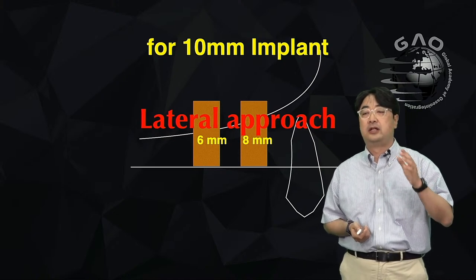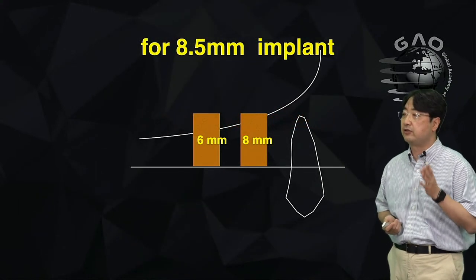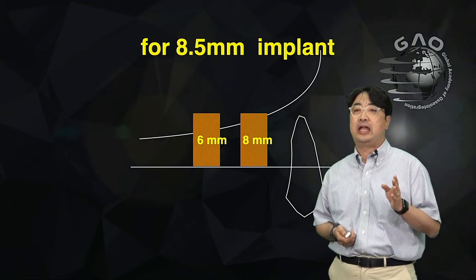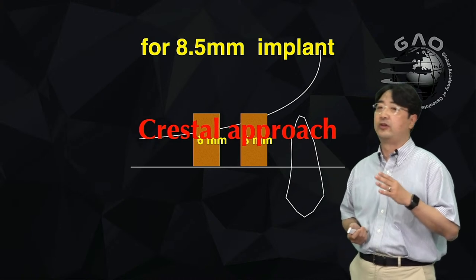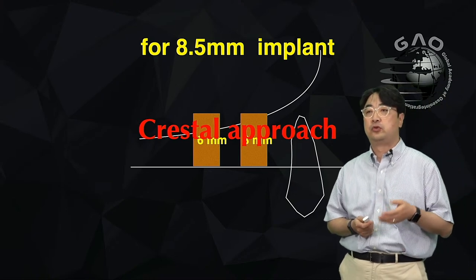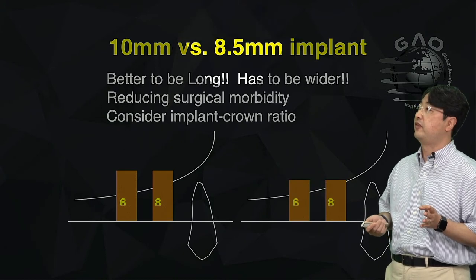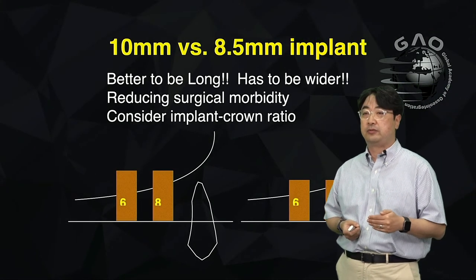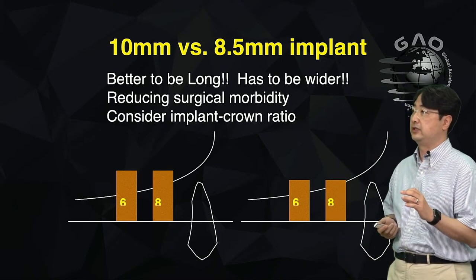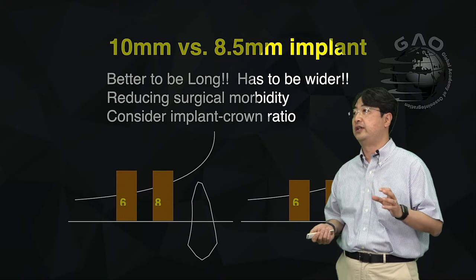But let's change the thinking when we do the lateral approach sinus graft. If you have 6 to 8 millimeters, but you're planning to place an 8.5 millimeter implant, what are you going to do? Then it's going to be covered with the crestal approach, maybe simpler than the lateral approach, right? So when you decide between 10 millimeter or 8.5 millimeter, it depends on the situation. You have to think about the crown implant ratio and the space to the antagonist as well. But you have to think about this: better to be long and has to be wider, okay?